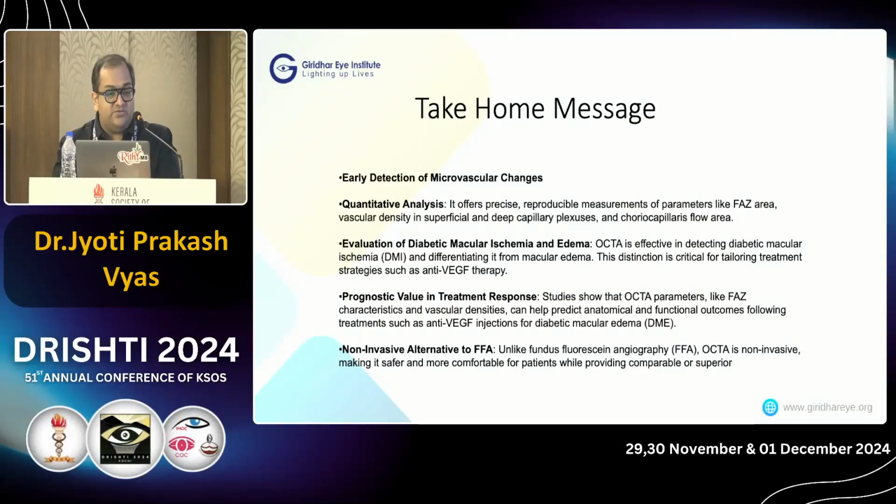So the take home message would be, although OCTA has all these benefits, it has to be taken with a pinch of salt. It is yet about time that we mature on to this investigation, but we need to update ourselves regularly to use it across different indications and for interpreting it reliably.